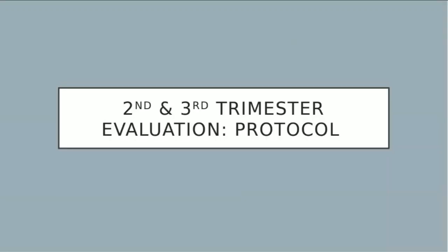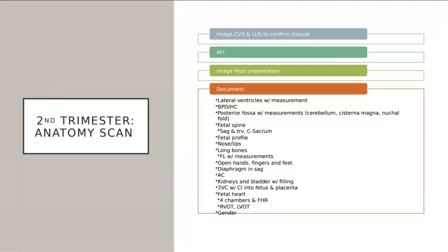So we're going to be talking about some of the different types of exams that you could do depending on the patient's clinical reason. So our standard anatomy scan, this is something that every pregnant woman is going to be required to have. This is looking at all of the different organs and structures of the baby just to make sure that development has happened properly and is going to continue to happen properly. We're typically doing anatomy scans anywhere between 18 to 24 weeks. The sweet spot's going to be right at 20 weeks. We can see everything as well as possible without worrying about all of that further ossification from all of the bones that are developing as well.